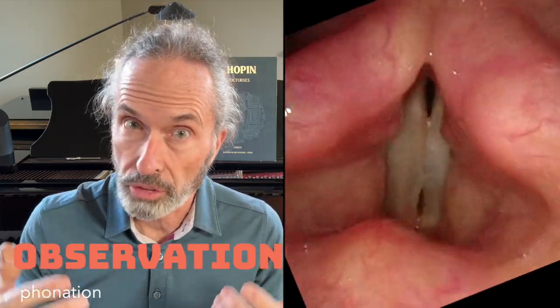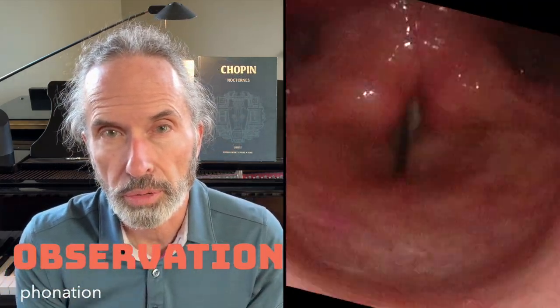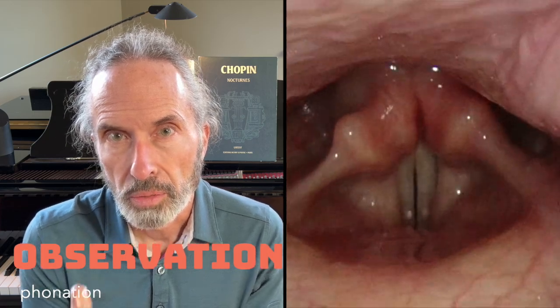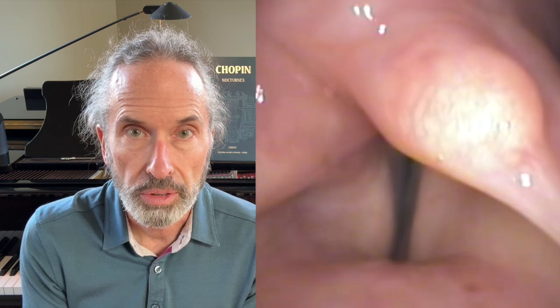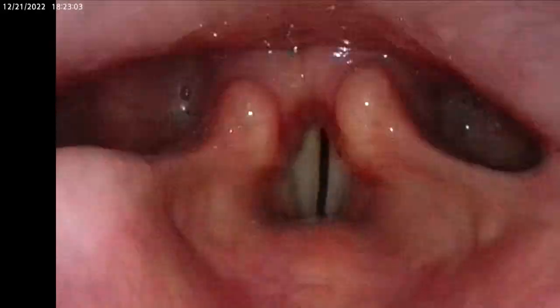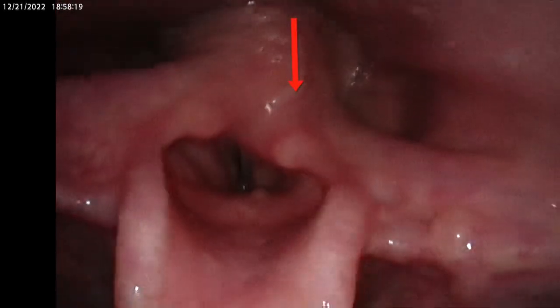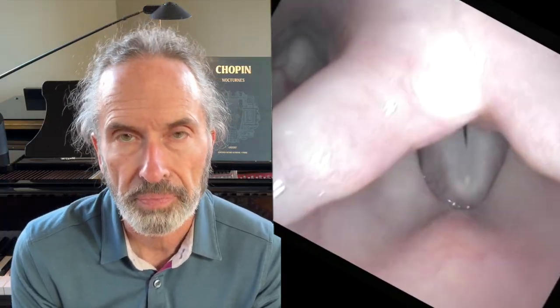We've been watching the vocal processes during respiration. One of their main uses is during phonation, bringing the vocal cords together so you can blow air through and make them vibrate during phonation. And this is when we most want to see them for causes of hoarseness. However, many times the view is obstructed by the arytenoids. The arytenoids sometimes are tipped forward and cover up this vocal process that we've been wanting to look at.